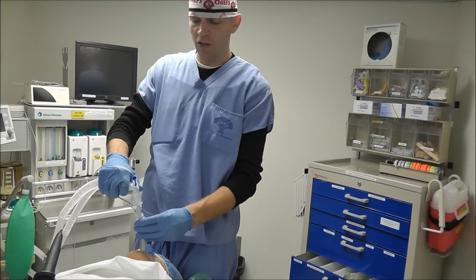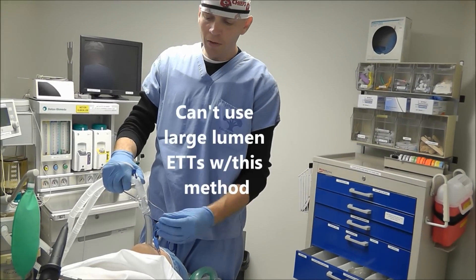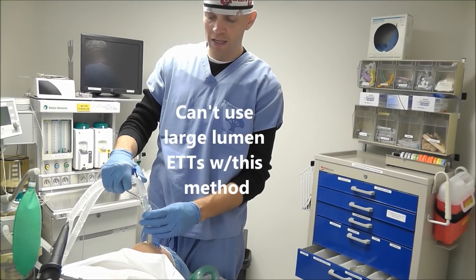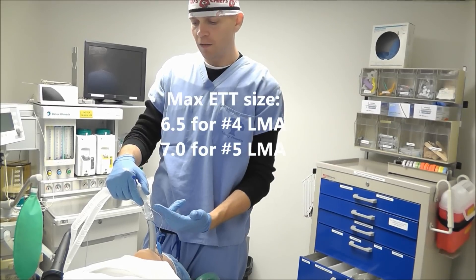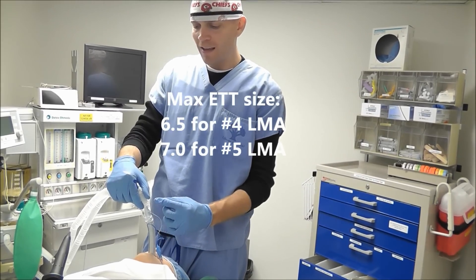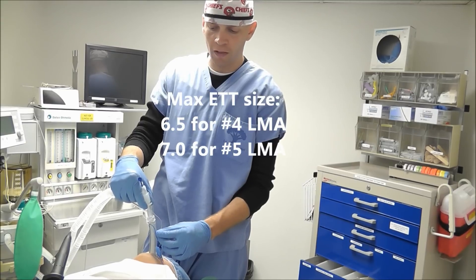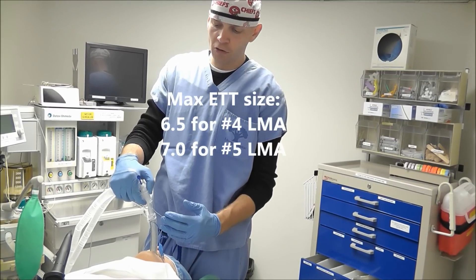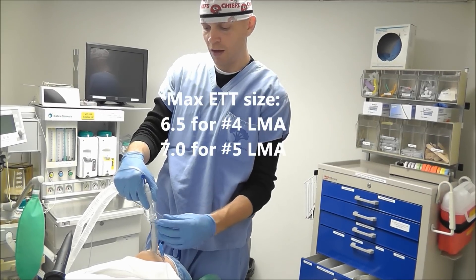There are a couple of disadvantages with this technique. Number one, I'm limited on the size of endotracheal tube that I can use. The max size endotracheal tube I can use is a 6.5 if I'm using a number 4 LMA, and the max size is a 7.0 endotracheal tube if I'm using a number 5 LMA.